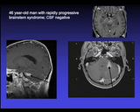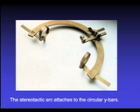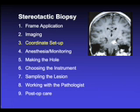This can be approached via a transcerebellar route. He also has lesions within the midbrain, as seen in the upper right image. When the stereotactic coordinates are obtained, they are attached to the base ring of the frame, such as here. One can see the Y coordinate of the Leksell frame and the Y bar attached, which holds the Z coordinate. This will then be attached to the stereotactic arc, which will then hold a probe for the purpose of surgery.